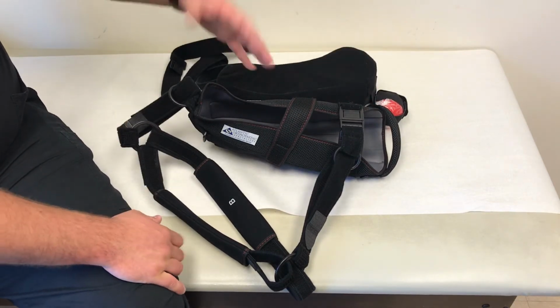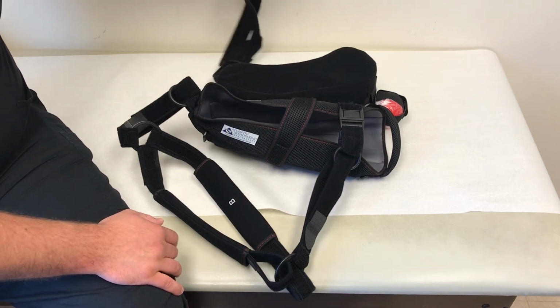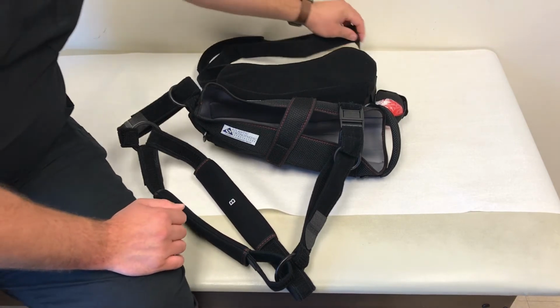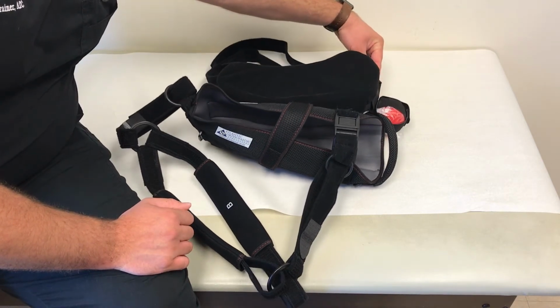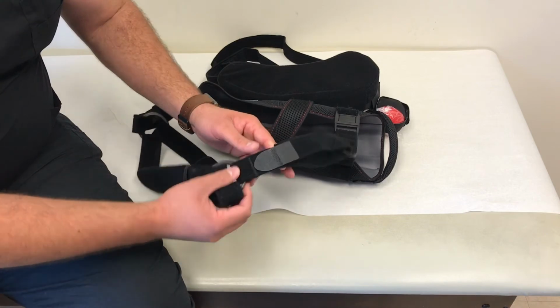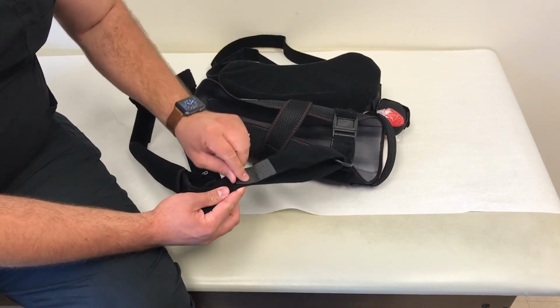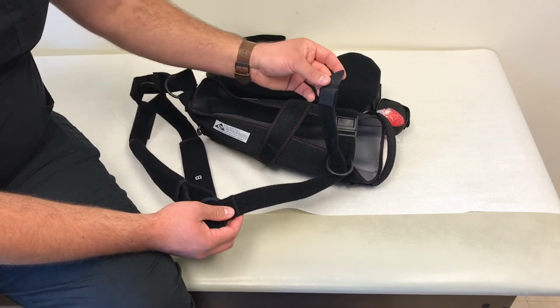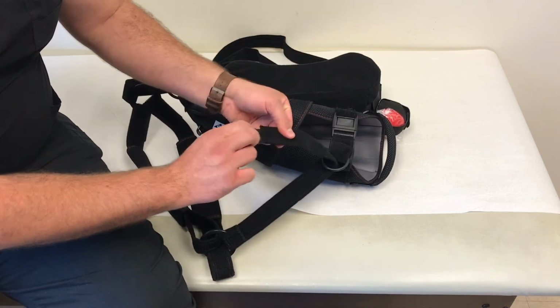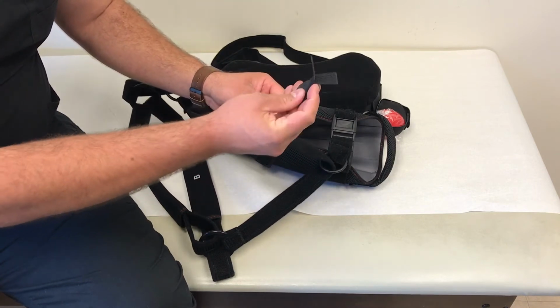Lastly, after you have your arm in there, you kind of have to figure out a way to pass around your body or have a friend help you, and then reattach it to the front of the sling up here. To review more of the straps and how they work, strap A is in the front, like I said before. Each strap has what we call alligator Velcro, which is a removable end piece of Velcro. It comes out just like that.